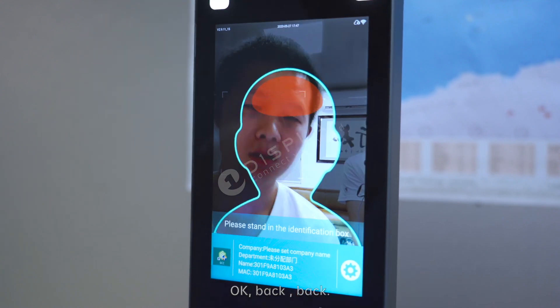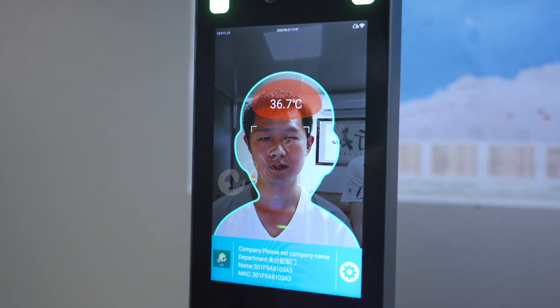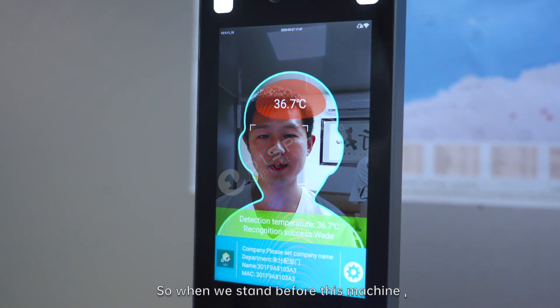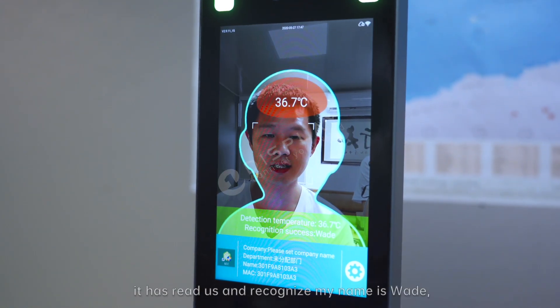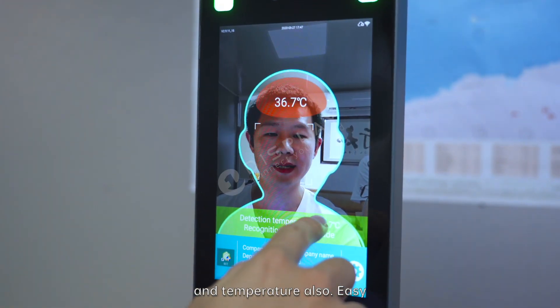Back. The machine says: please align with the temperature measuring point — the temperature is normal. 36.7 degrees. When I stand in front of this machine, it reads my temperature and recognizes that my name is Wei. It shows my temperature as well.